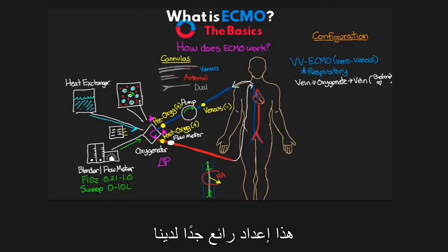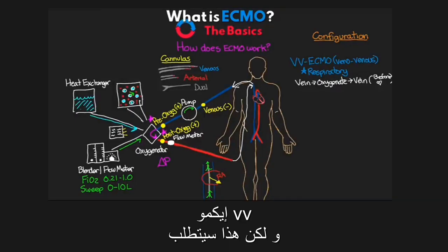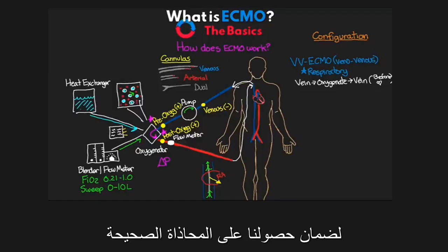This is a pretty cool setup that we have here. Really makes it easy just to use a single cannula for patients on VV ECMO, but this one is going to require inserting this cannula under fluoro to ensure that we get the proper alignment.